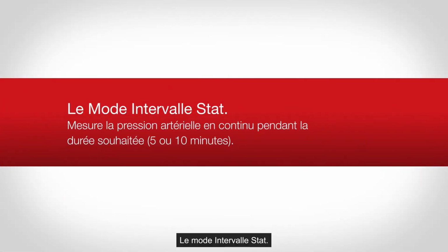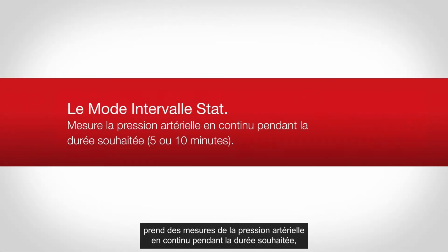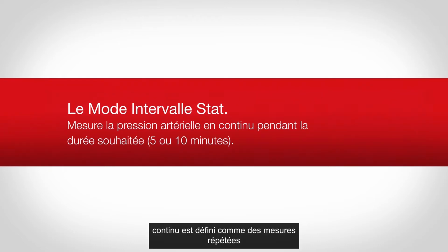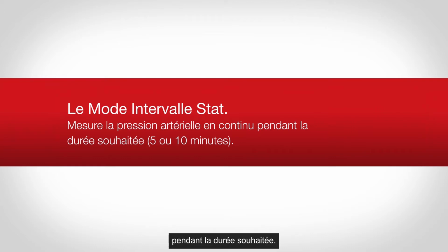Stat interval mode will take blood pressure measurements continuously for the desired duration, 5 minutes or 10 minutes. In this mode, continuous is defined as measurements that are repeated one after another for the desired duration.